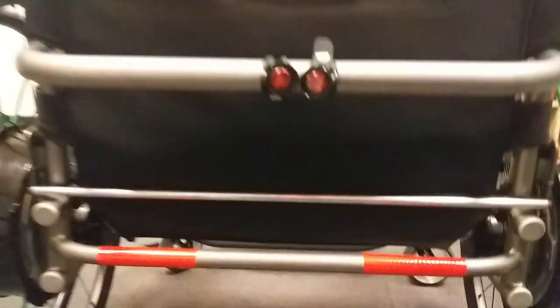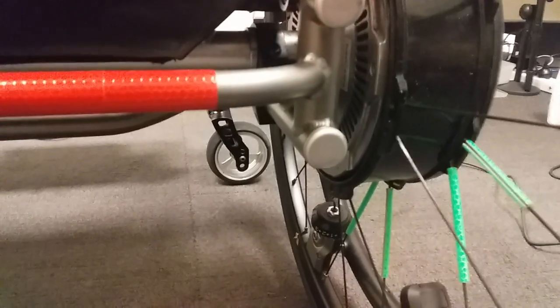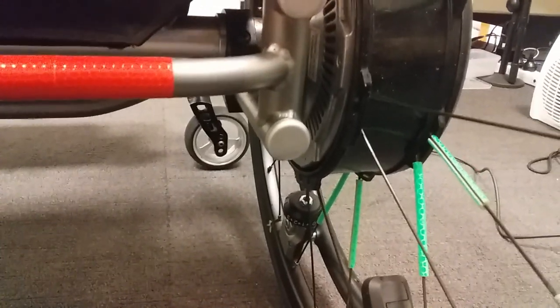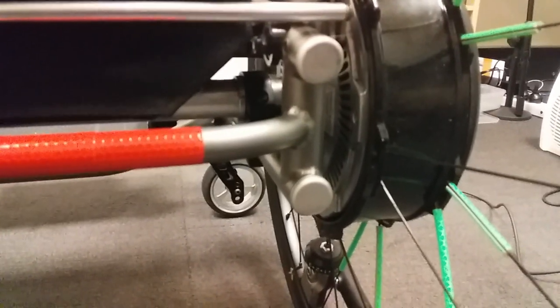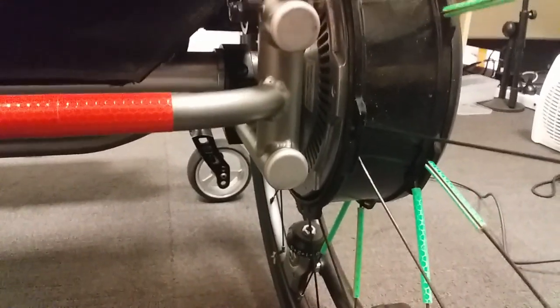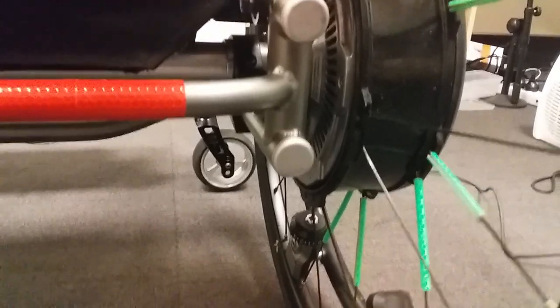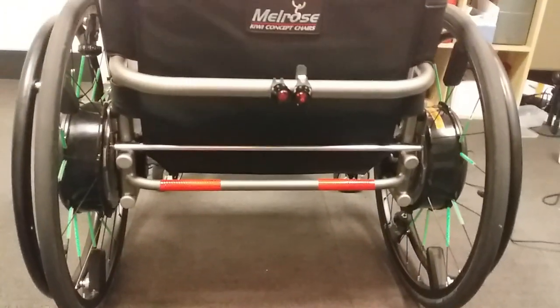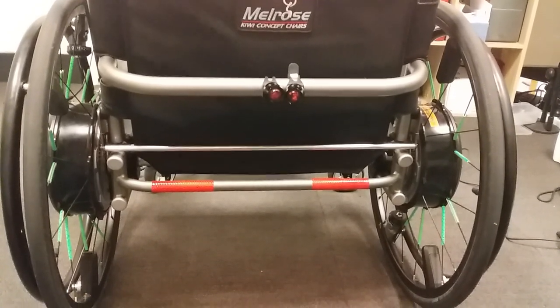There are changes about to happen to this chair. As you can see, I don't have any tipper bars. The next stage of getting this chair back to safety is that people want me to get tipper bars due to the fact that I've fallen out of this chair about half a dozen times since I've been here. It's all to do with the wheels being too powerful and quite fast at times.